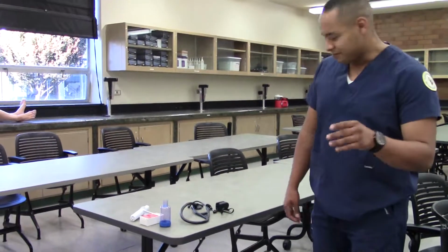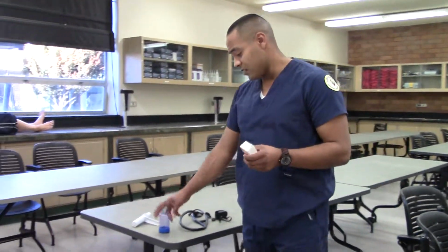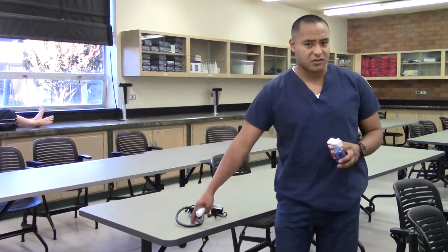Good. Hi, my name is Race. I'm an RT student. I'm doing an MDI competency. I'm going to be using my MDI, spacer, peak flow, and stethoscope and pulse ox.